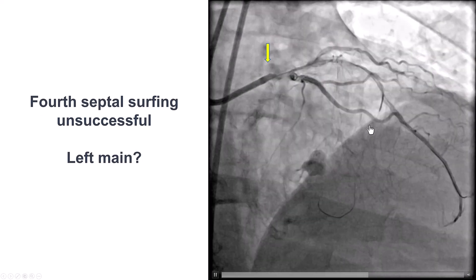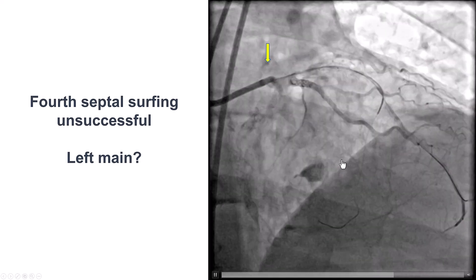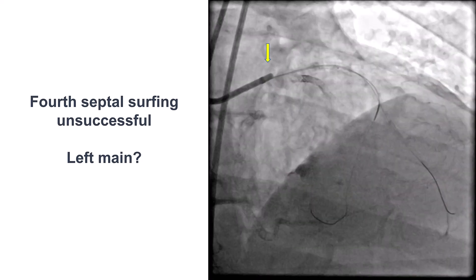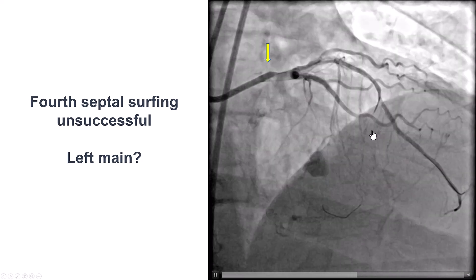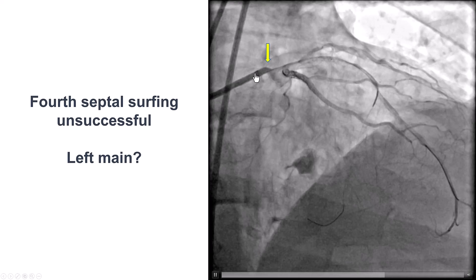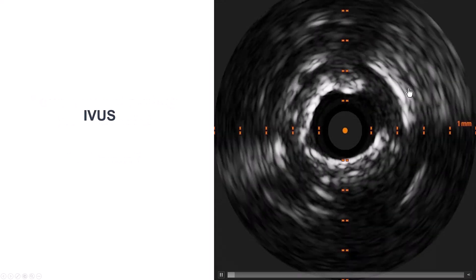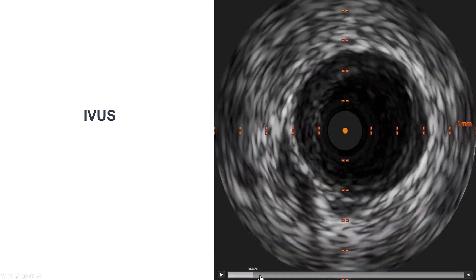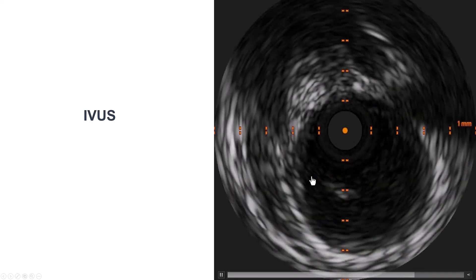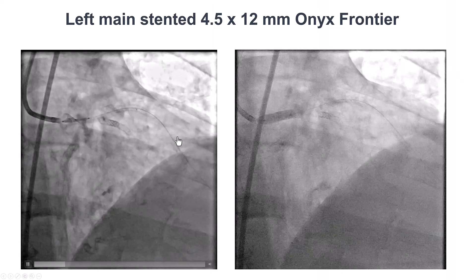We tried another septal crossing, but once again the wire did not make it all the way. One more thing we noticed — which was actually present in the previous film, but sometimes it's hard to realize when we're focusing so much on a specific portion of the angiogram — is that there was an area that looks suspicious in the left main. So we have essentially a flap. It looks like a left main dissection.